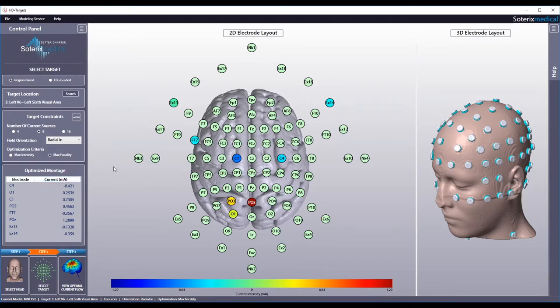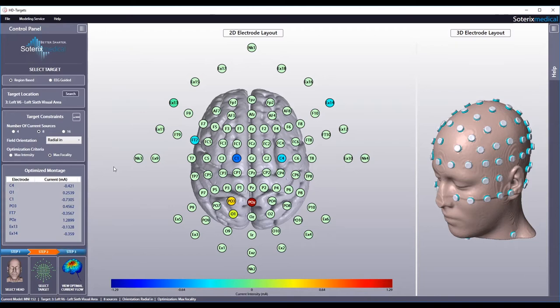Soterics Medical HD Targets automatically calculates the most optimal electrode montage based on the criteria you indicated. This is illustrated by the 2D electrode layout in the middle and the optimized montage table on the left. For each electrode indicated, the current you need to apply to that electrode is indicated in the false color map.